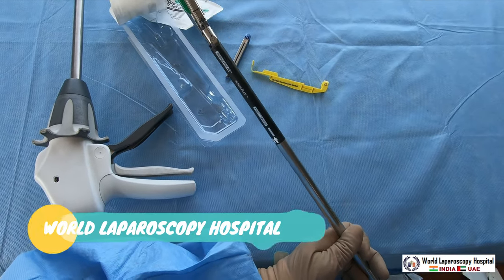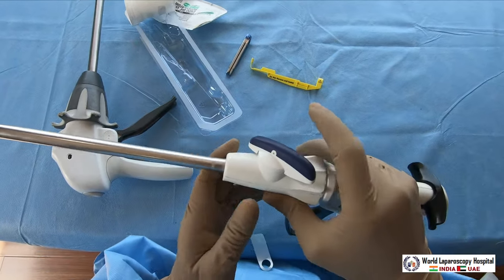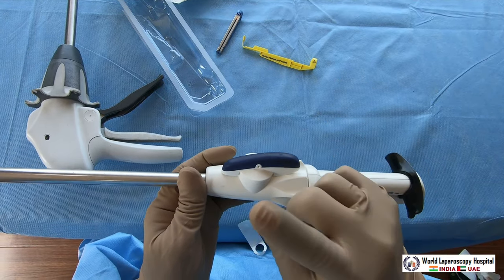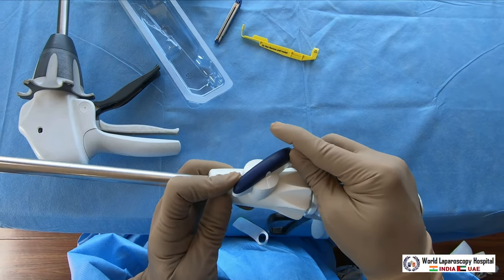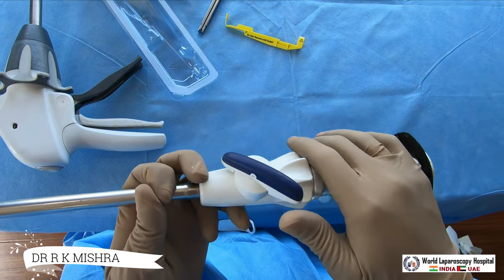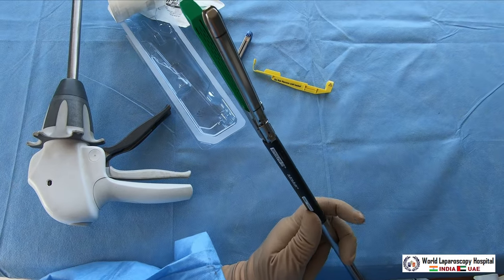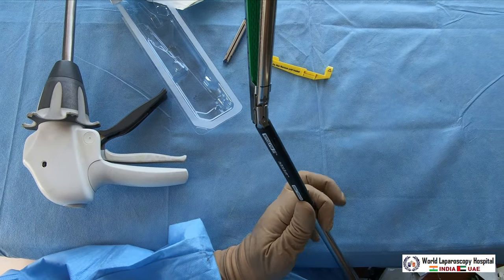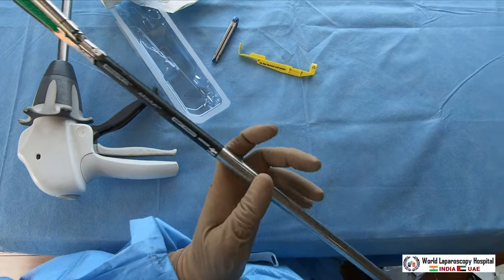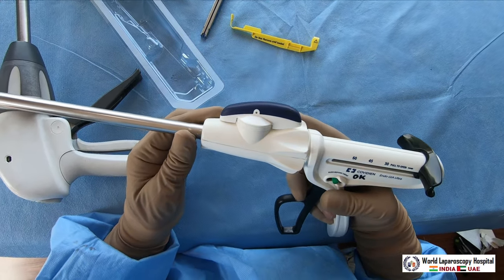This stapler is also a roticulator. You can rotate it anytime. There is a knob - in the neutral position it is in a straight line. Rotate the knob to the left and it rotates left; rotate to the right and it goes right. With every click, 15 degrees of rotation occurs. At the tip you can see the articulation - it can also articulate in the left direction. Rotation is controlled from this knob, and articulation from a separate control.